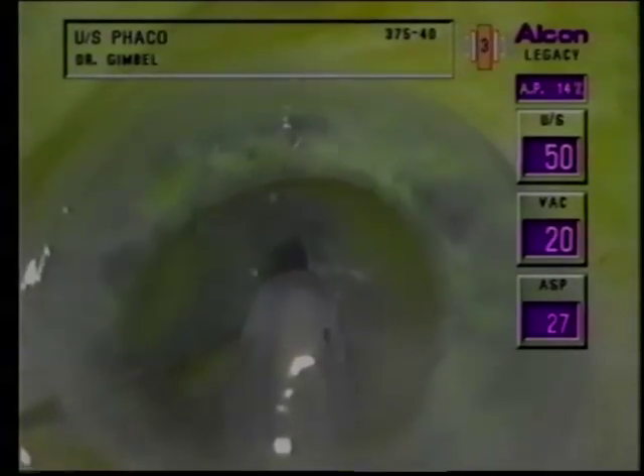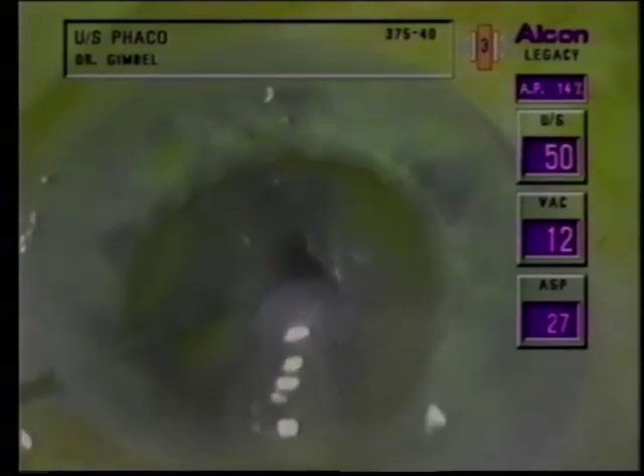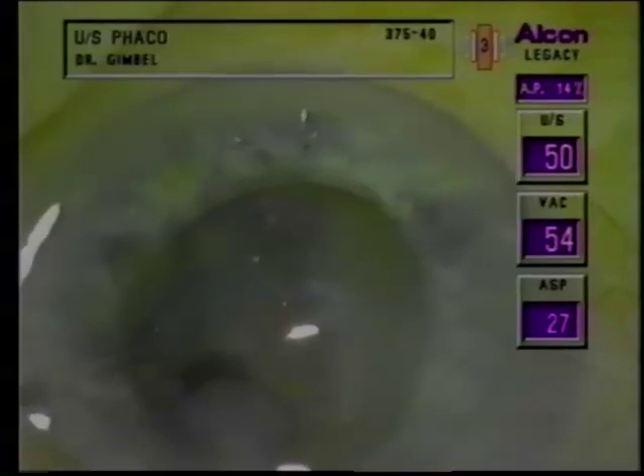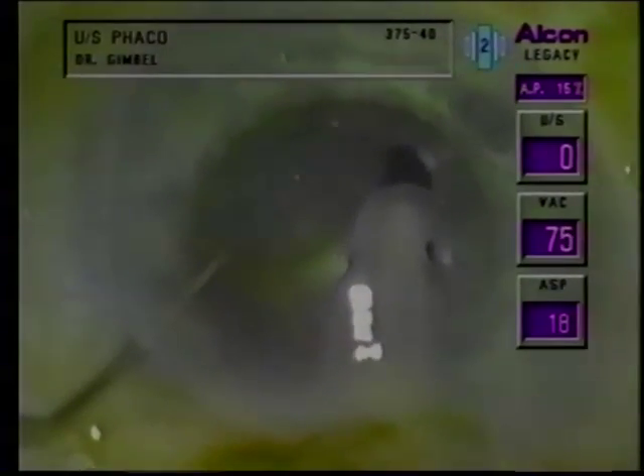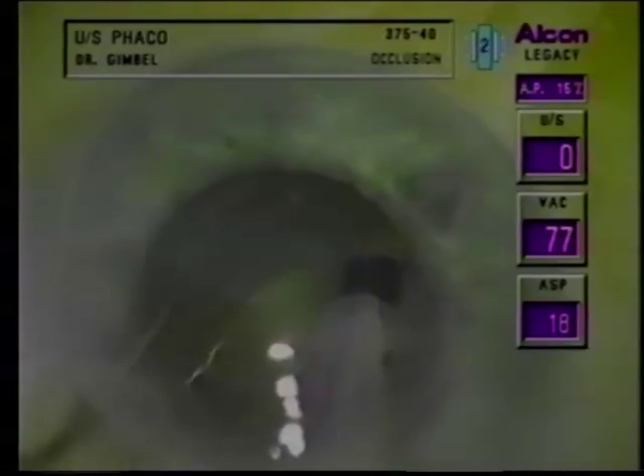This case has been slowed down 30 percent in order to illustrate my multi-directional divide-and-conquer technique. After the superior portion of the lens has been debulked, the two instrument tips are placed deep in the nucleus. The spatula pushes inferiorly into the nuclear wall while the phaco tip pushes superiorly, creating a horizontal fracture. The tips are then positioned in the deep vertical groove, and a vertical crack is created intersecting with the horizontal fracture. Depending on the density of the lens, the segments created can be removed or left in to stabilize the capsular bag.